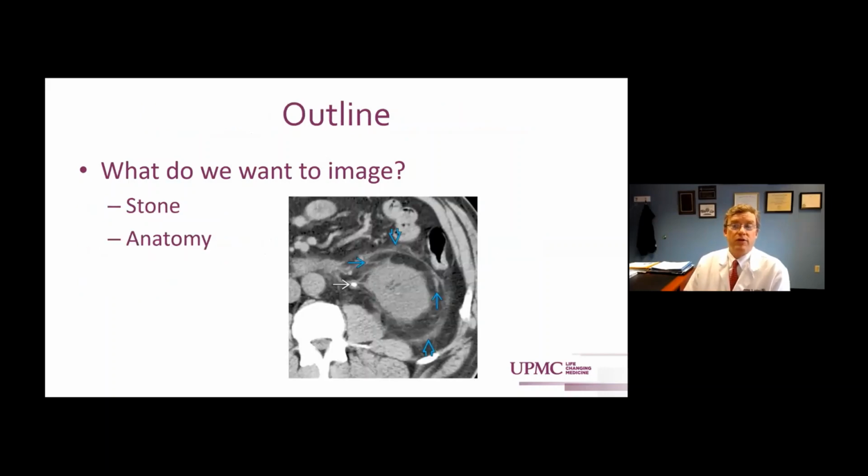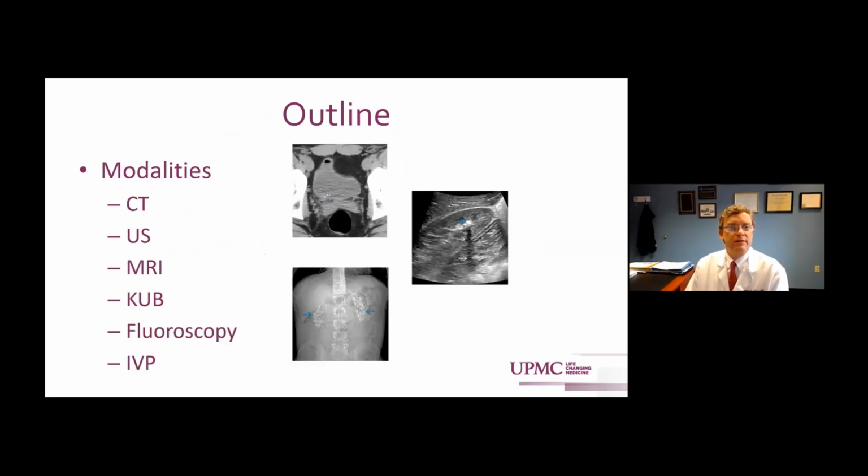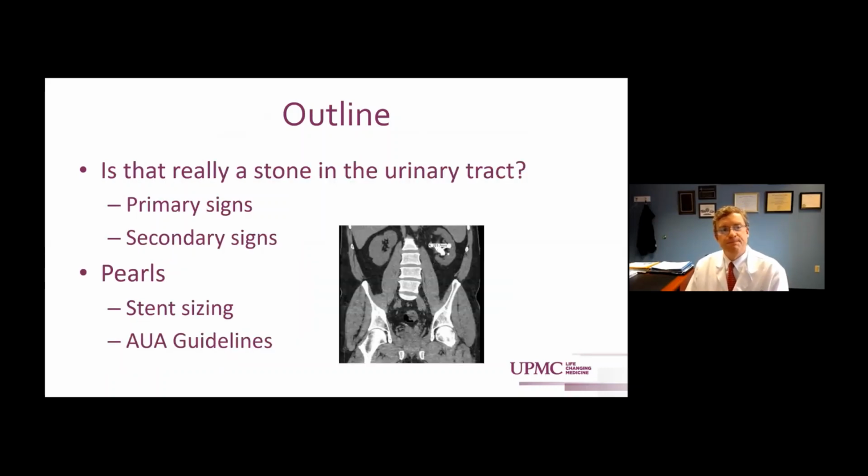What we want to image, of course, number one is the stone, but number two is the anatomy, and not just the urologic anatomy, but the surrounding anatomy. And we'll talk about that in some detail. The modalities I'll discuss include the most common ones, although I'm not going to go into great detail on some of them, including, say, renal scans, which is really beyond the scope of this.